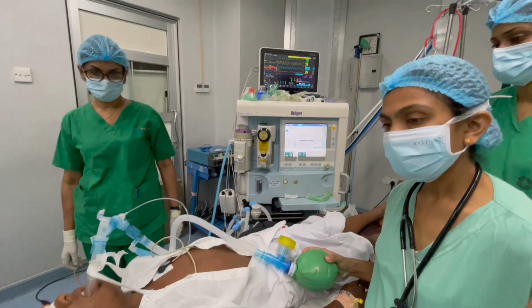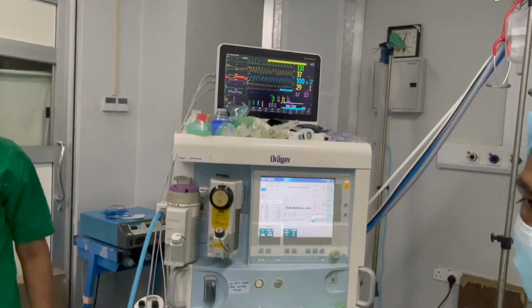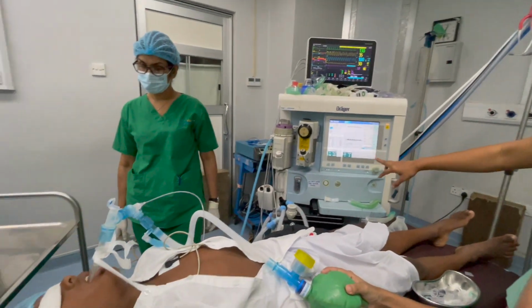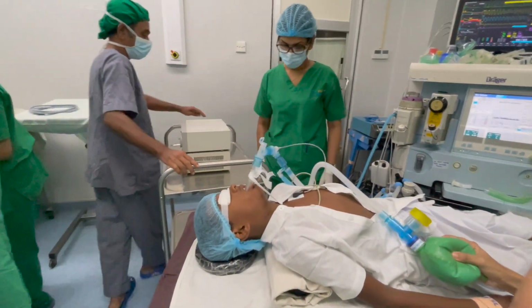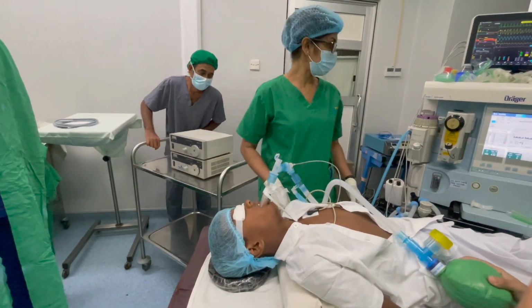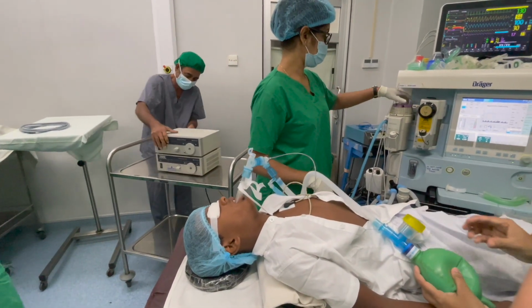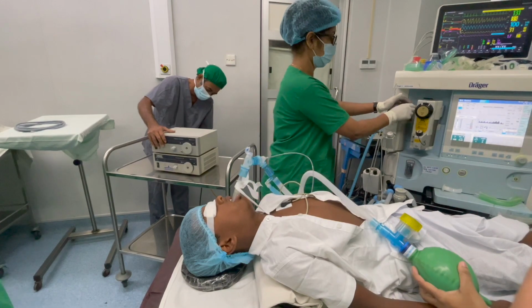In this video, we witness a fascinating and intricate medical procedure involving the retrieval of a nail from the right bronchus using rigid bronchoscopy. Rigid bronchoscopy is a specialized technique used to examine and treat conditions of the airways, providing a direct view and access to the bronchial tree.